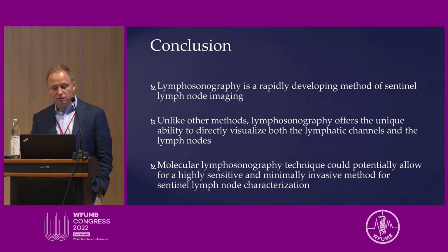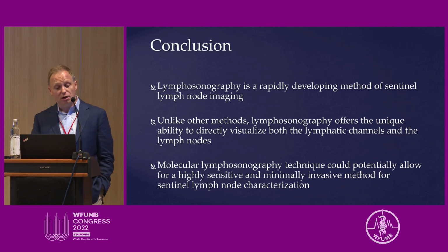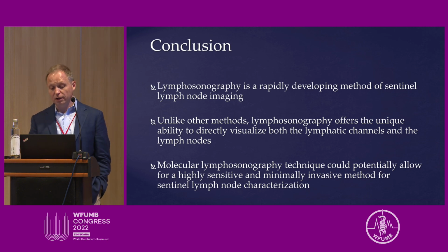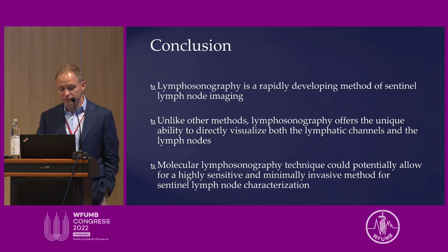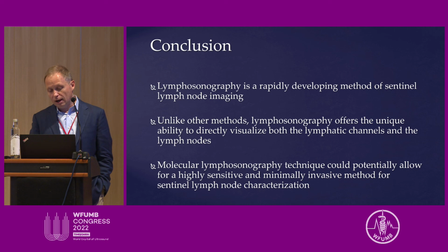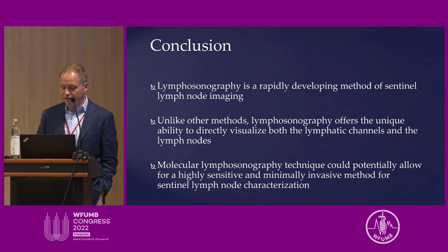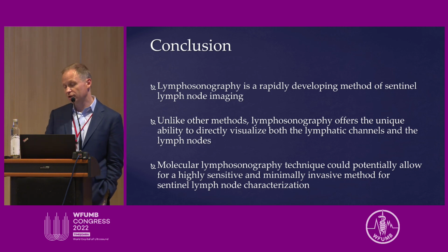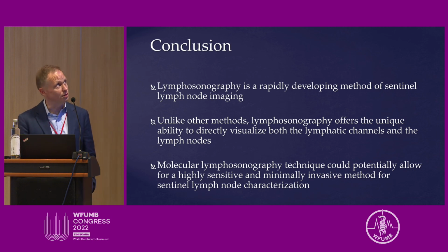So as a conclusion, lymphosonography, I think, is a very interesting and rapidly developing method of sentinel lymph node mapping. It's not perfect, but it's much better than the current quote-unquote clinical standard of care of nuclear medicine lymph node mapping. Unlike other methods, it offers a unique ability to directly visualize both lymphatic channels and lymph nodes, and you can guide the surgeon to take them out when you see them.